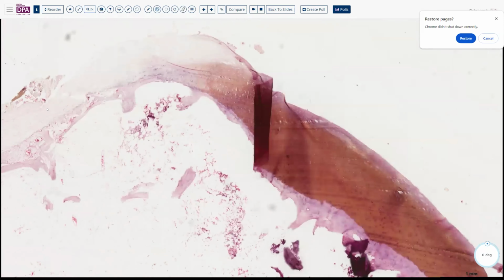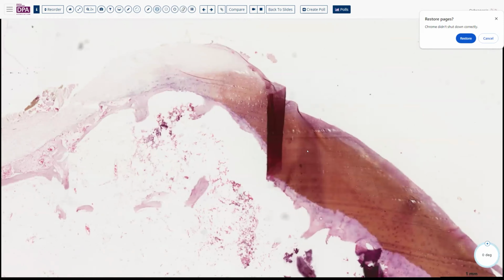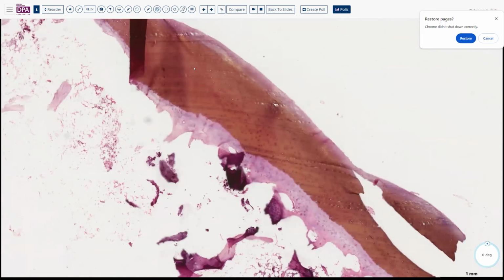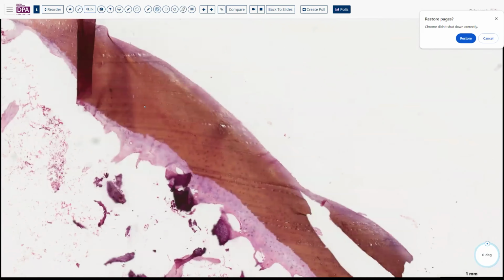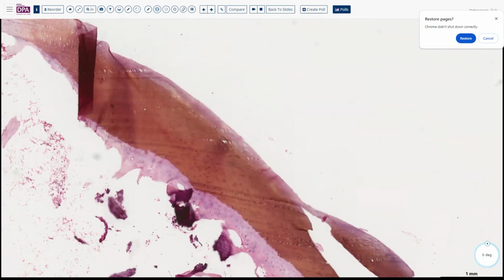So what can cause this kind of discoloration in an older adult patient who's undergoing joint replacement? Well, as you may have surmised from my interest in Gaucher's disease, I do have some interest in various metabolic disorders. And this is an example of another metabolic disorder. In this case, a patient with alkaptonuria or ochronosis.